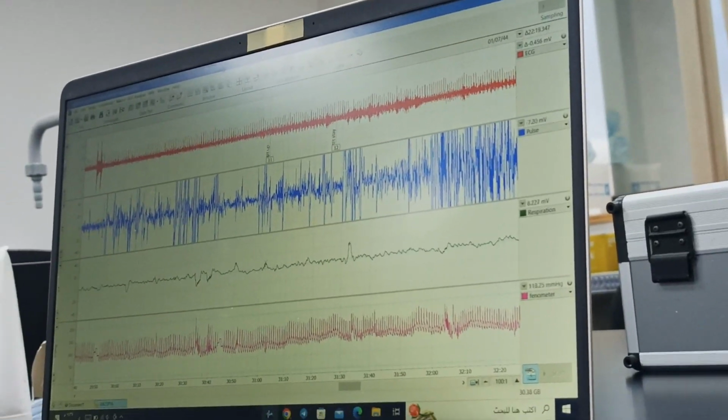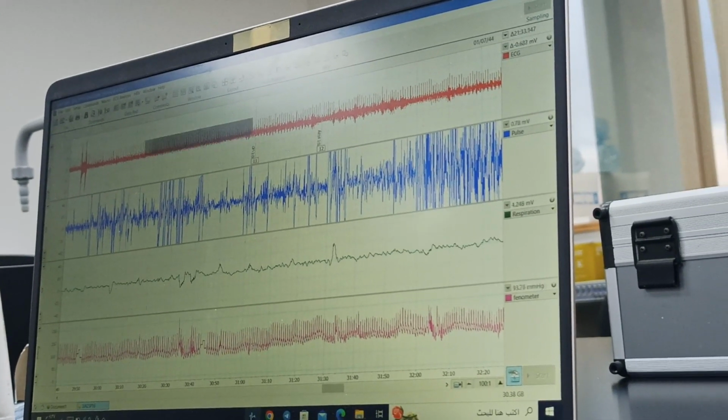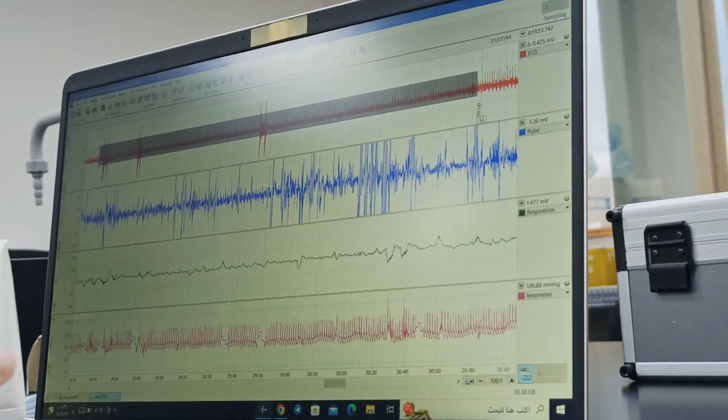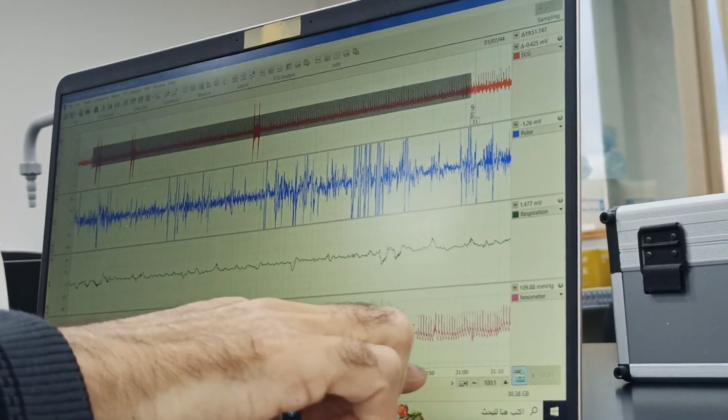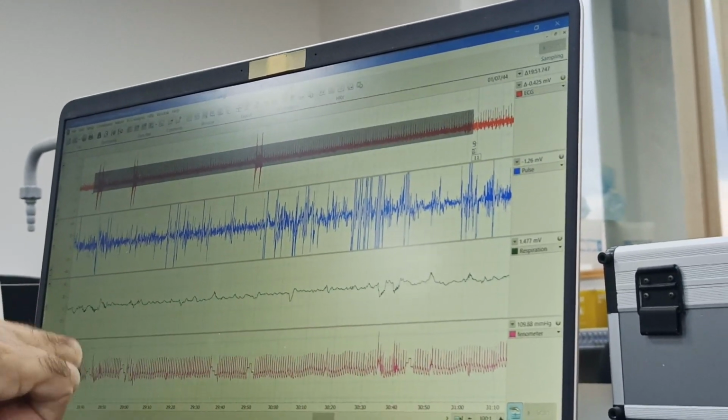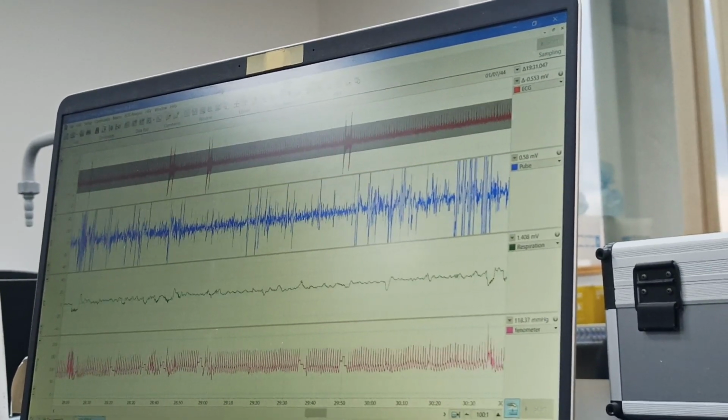So what I will have to do, I will have to select 5 minutes before the tilt. Where does it show the time? It's 5 minutes. Time is from here. So this is 30 minutes, 31. So you should be at 26.